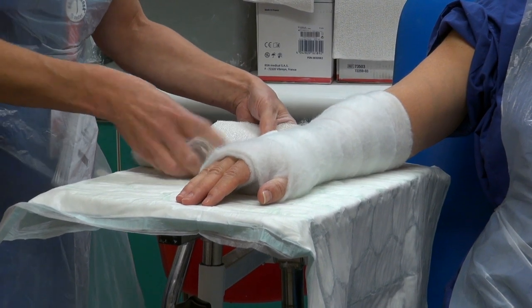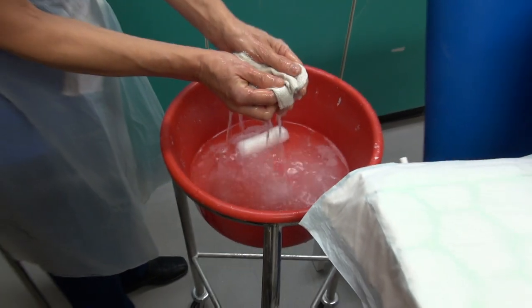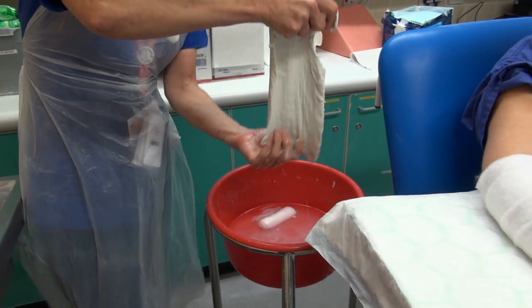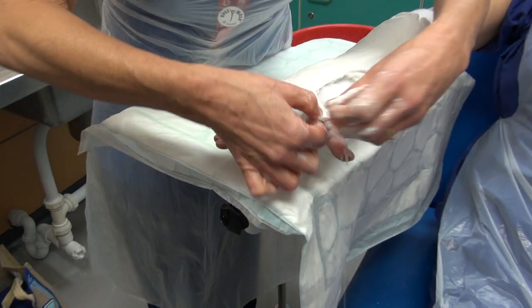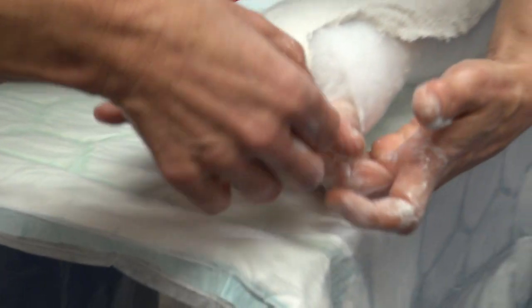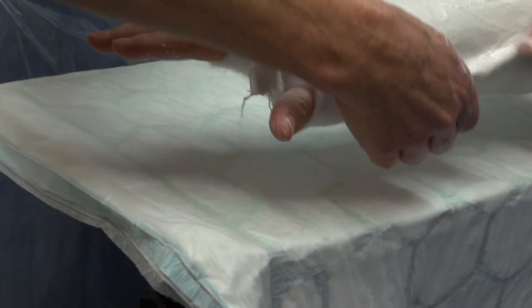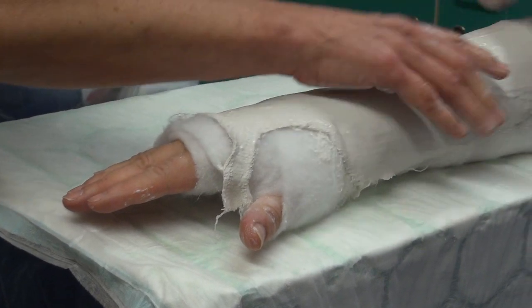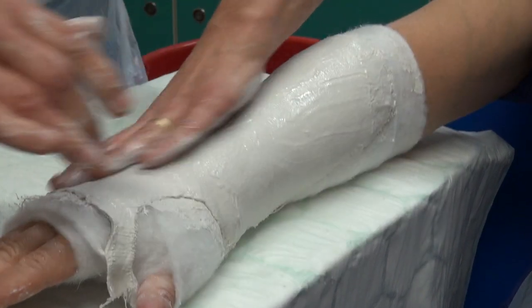So as I said, my water is lukewarm. I take hold of my plaster, keep the ends together, pop it in keeping hold of the ends, and give it just a little squeeze — I want to keep some moisture in there. Make sure it's all nice and straight because I don't want any creases inside. I'm going to pop it onto Mag's wrist, putting that little piece through there, making sure it's not rubbing against the thumb, and smoothing around the wrist. We just need to make sure we laminate the edges together, and that it moulds around the wrist.